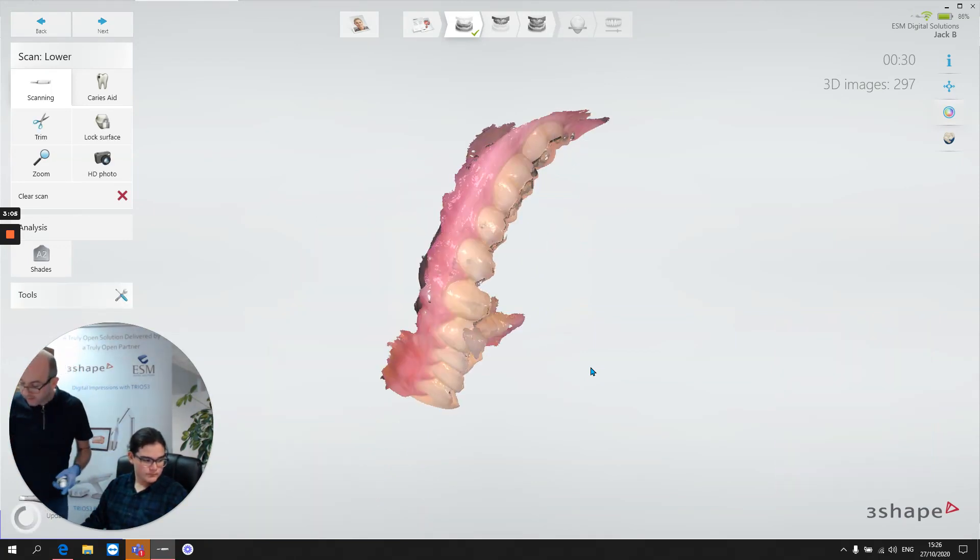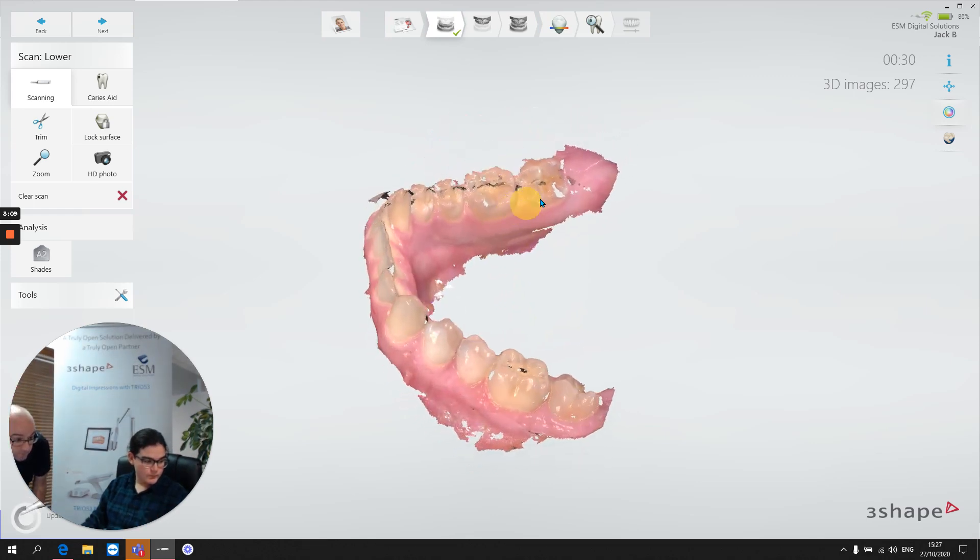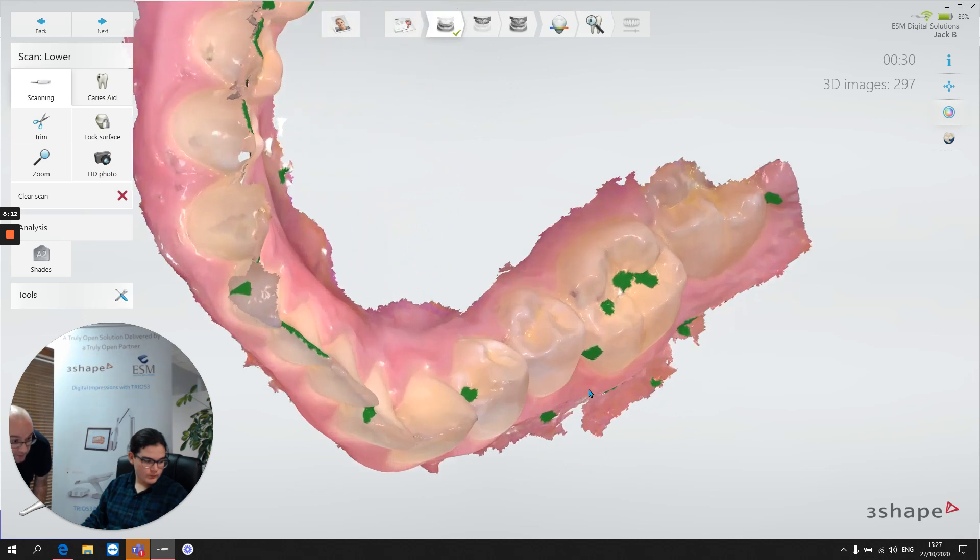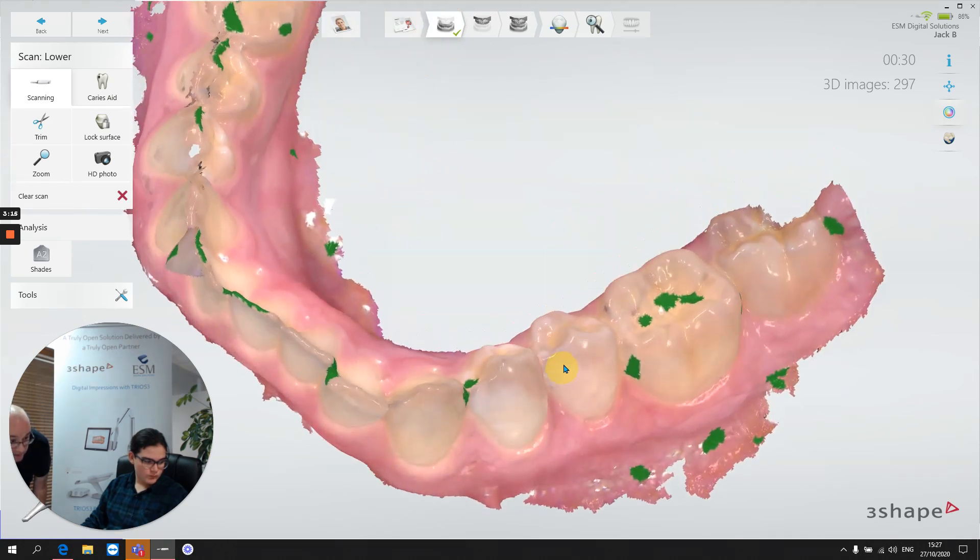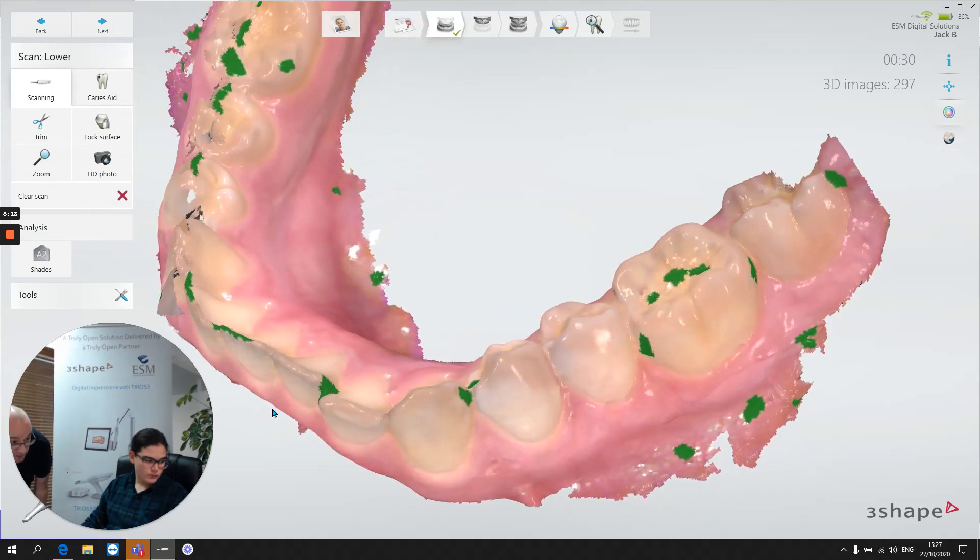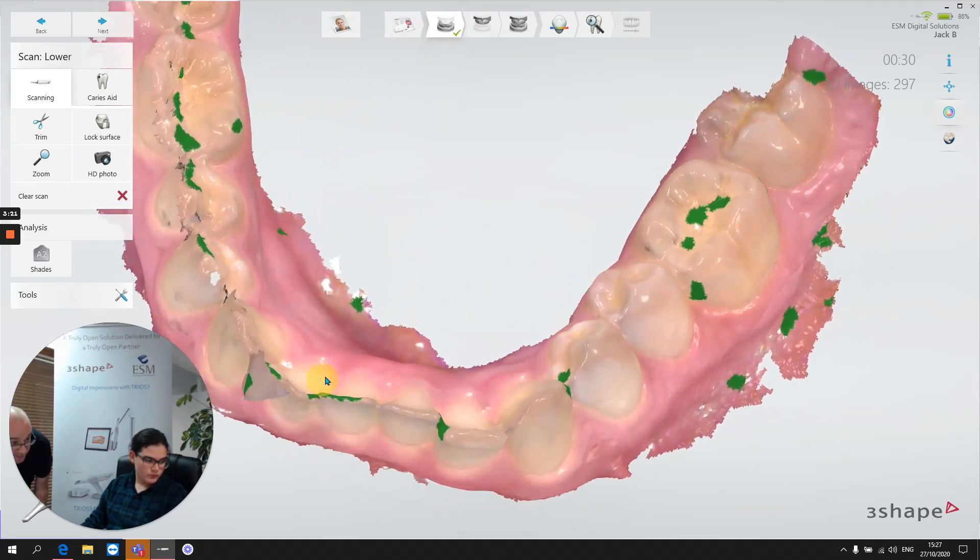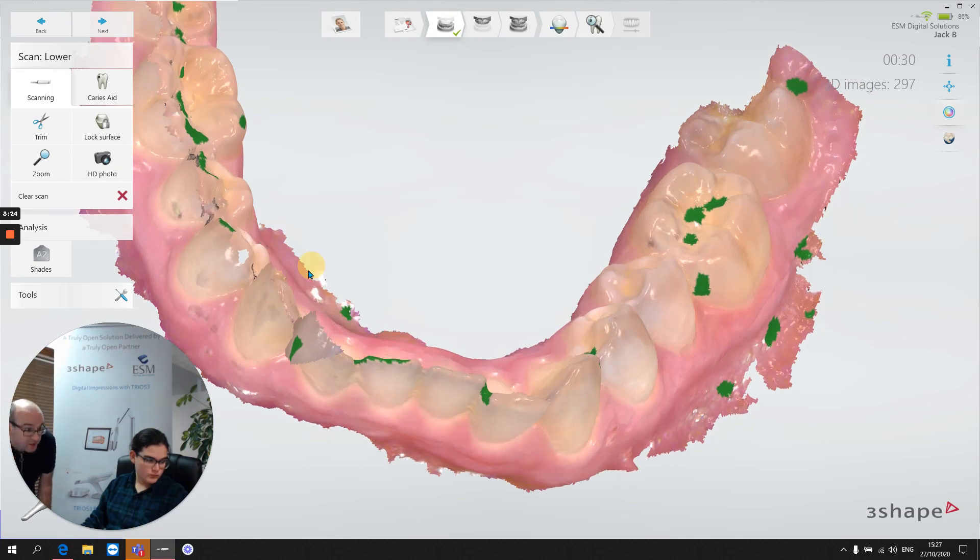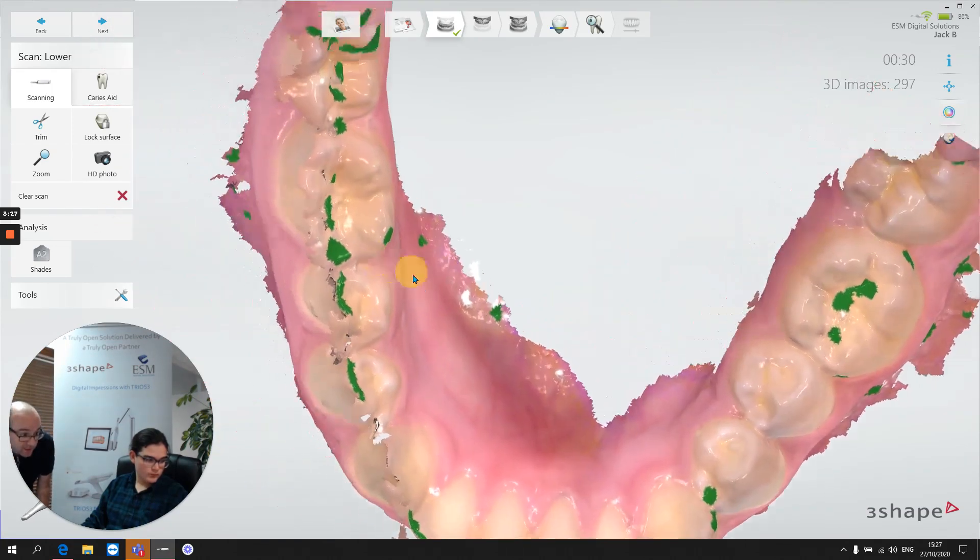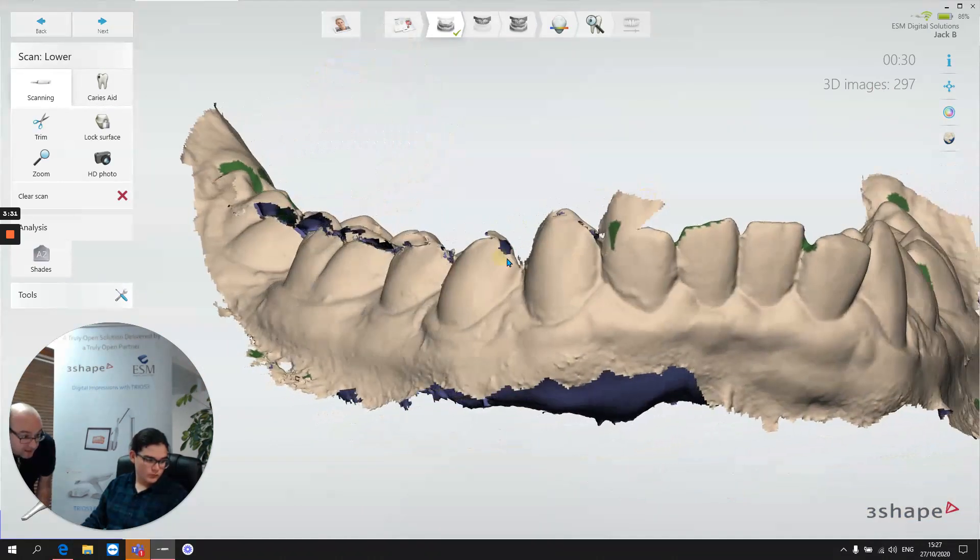I'm going to open up for me. You'll see, everything seems to be stitching together nicely on the left hand side where we started. But as we sweep around, what ends up happening is that the buccal scan doesn't appear to be stitching correctly with the occlusal scan and the lingual scan. And if we turn off the color, we get to see that a lot clearer.